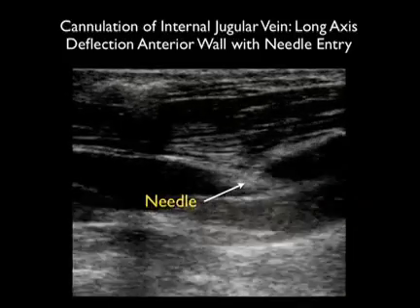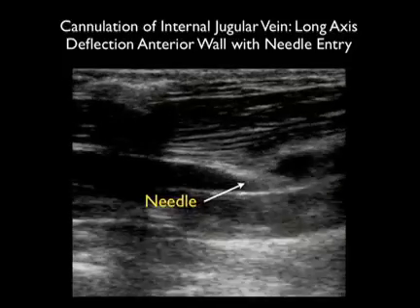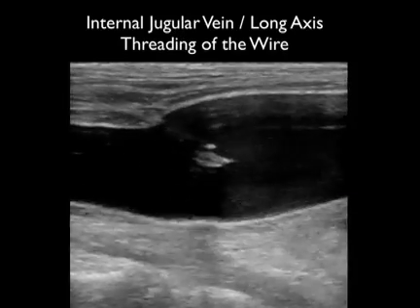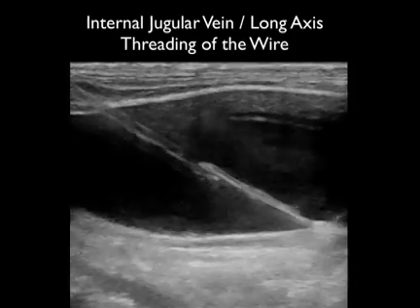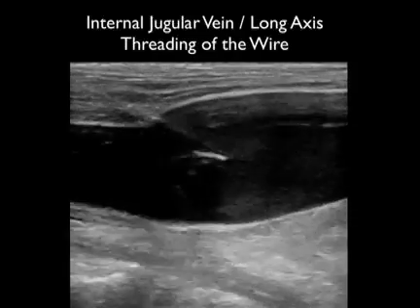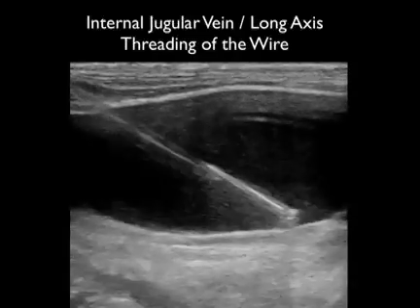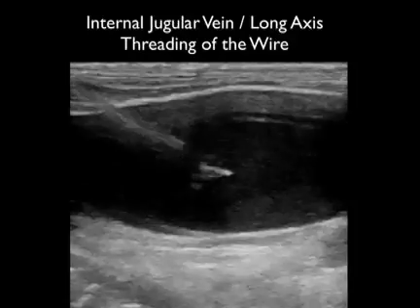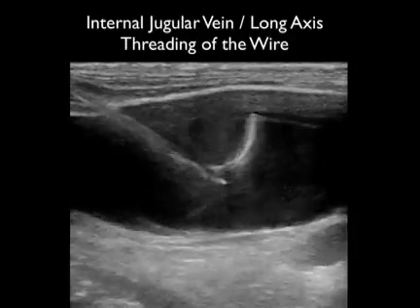Using the long axis technique, one can best adjust the needle tip depth and avoid puncturing the back wall of the vessel. Here's another great use of the long axis technique — confirming that the needle tip is located within the vessel lumen. We can then watch as the guide wire passes through the tip of the needle and moves inferiorly down the patient's internal jugular vein. This is a great way of confirming that the guide wire is safely parked within the lumen of the vessel before threading the catheter.